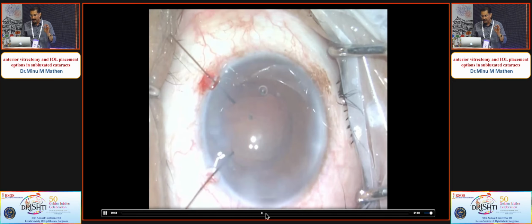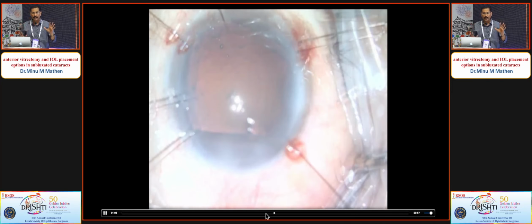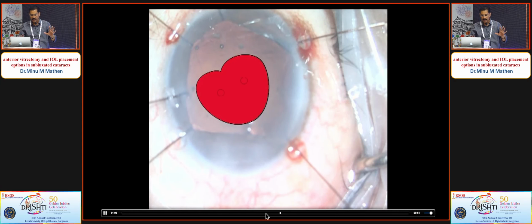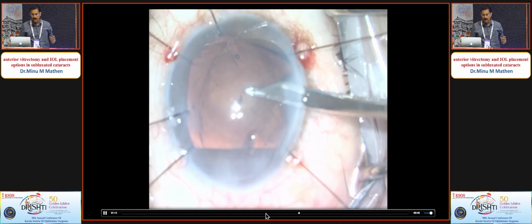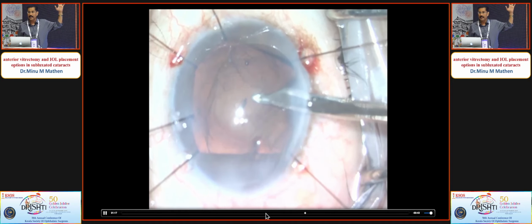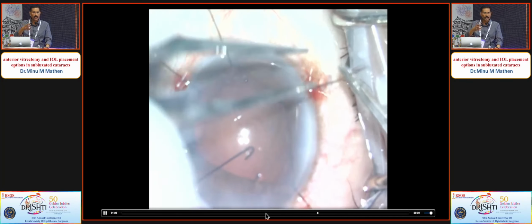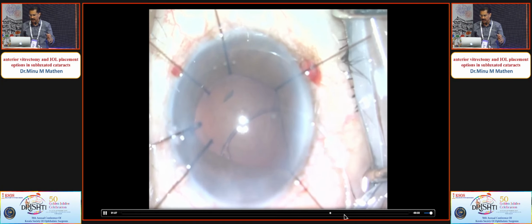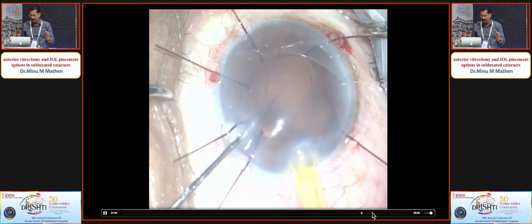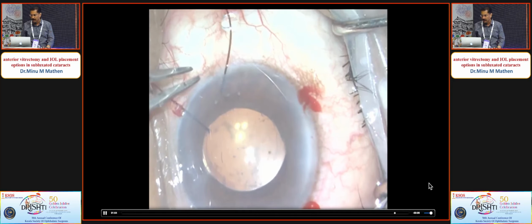And I finished the IA and then just try to identify, the pupil becomes small, and then identify where is your Rhexis. So the Rhexis is good and it was all going fine. I thought the bag is also stretched with viscoelastic very much. But when I was just trying to aspirate, see the bag separating off more than 180 degrees of bag subluxation. So here again I felt, because it was intraoperative, I could get away with the CTR, and a regular CTR goes inside the bag. Nothing new about it. The lens also goes into the capsular bag, and it is very well centered and nice looking at the end of this one.